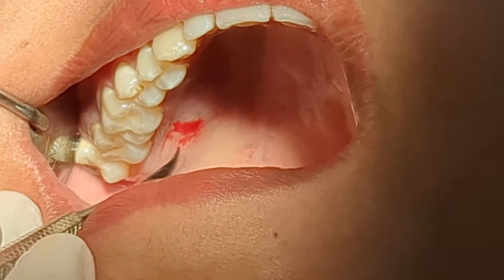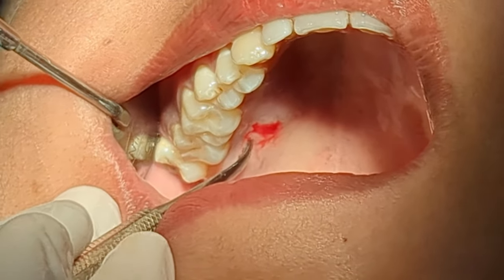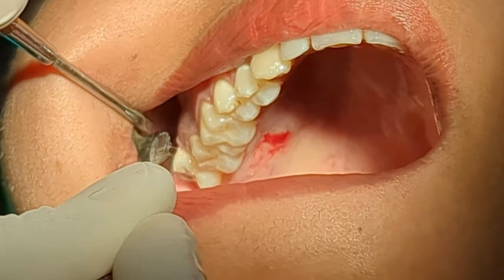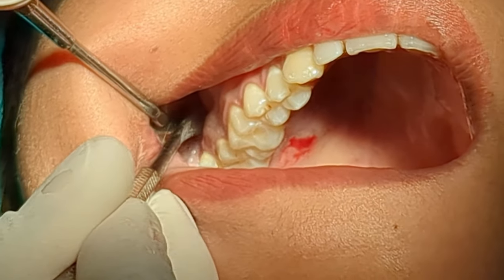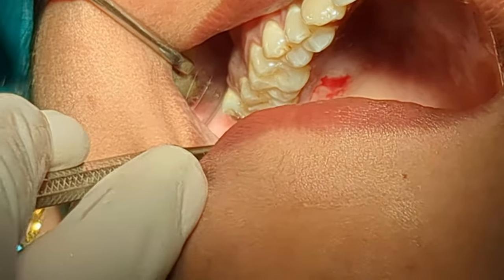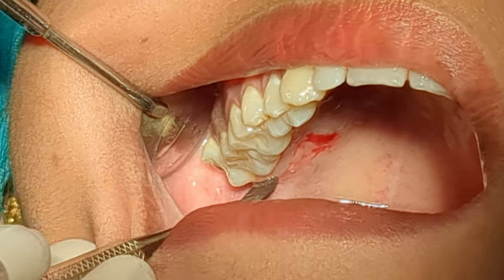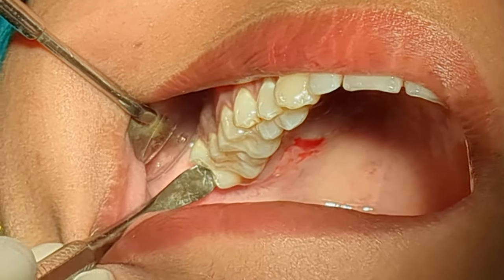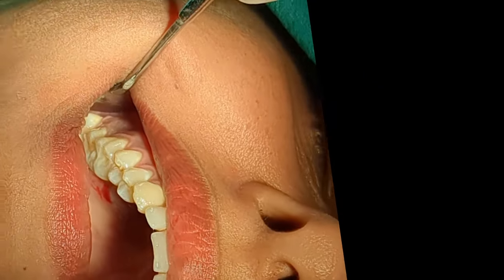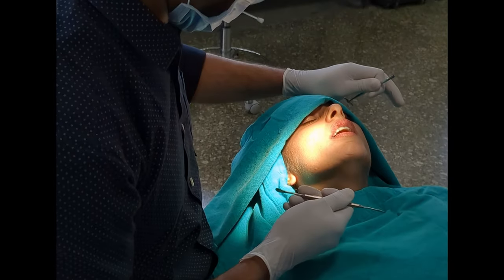For the palatal, I will check again. You can see the patient doesn't have any pain on instrumentation. You will get a little bit of pressure, but the rest is normal.